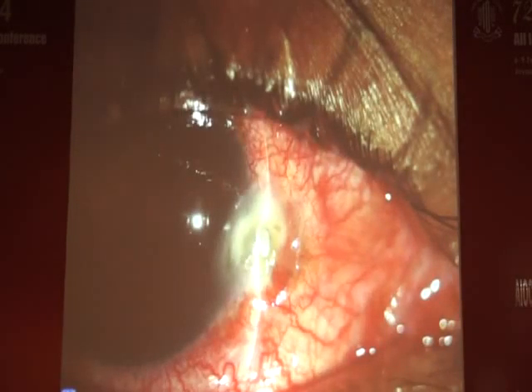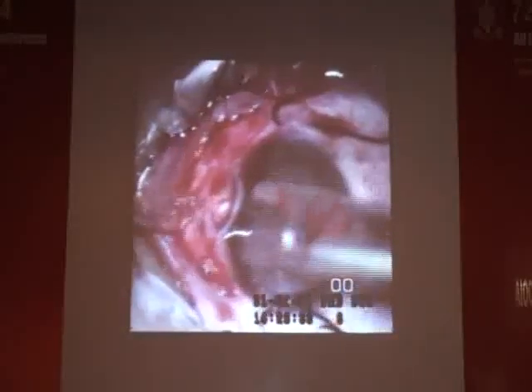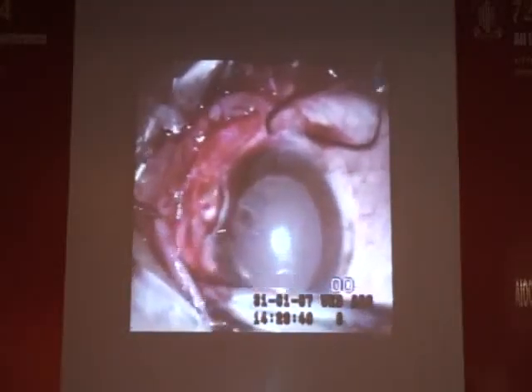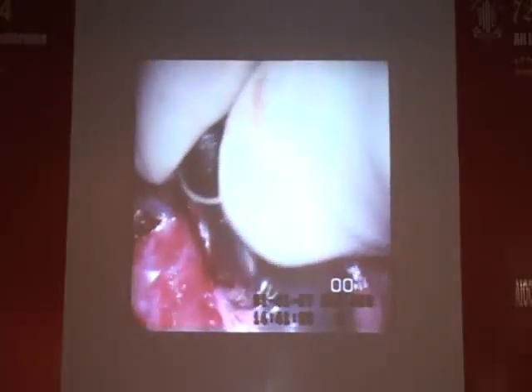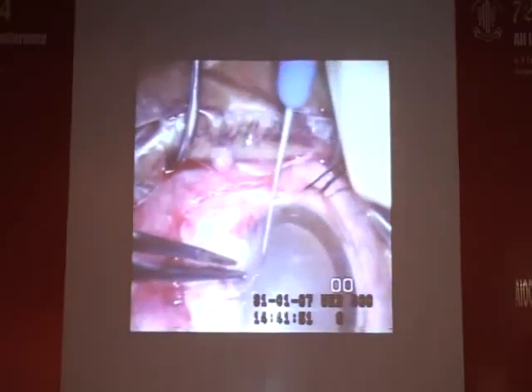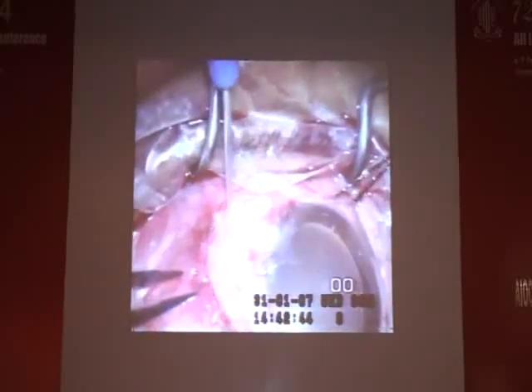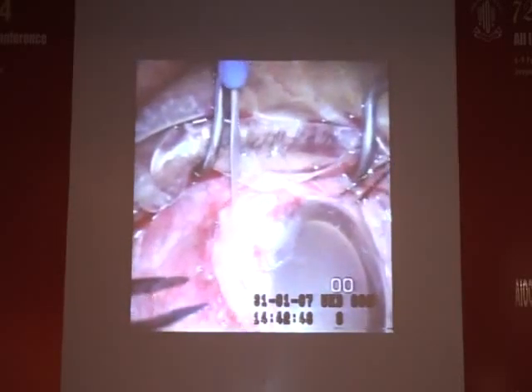You can also do them in situations where there's infection, as in this person who's post-pterygium surgery, referred with a deep infection which is fungal. The same principles again, although here you can use a trephine to give you a nice circular mark, 6 millimeters, or you make those vertical walls with a knife. If you have a diamond knife, that will be easier, but you can use a metal blade as well.